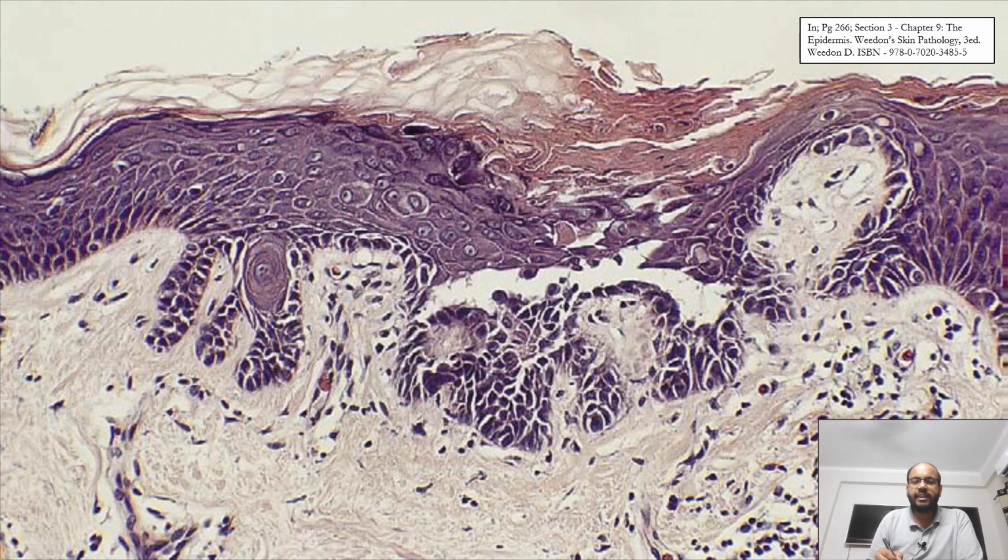So here in dyskeratosis, what do we look at? We look at the intraepidermal split. So here is a split. Why has a split occurred? Because the cells are not properly formed, and that is why the layers separate from each other. If the process were normal, for example, here the process is normally occurring, there is no problem here. So you see the normal biopsy, but here you can see the cells are not normal.